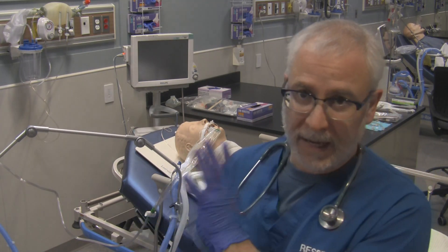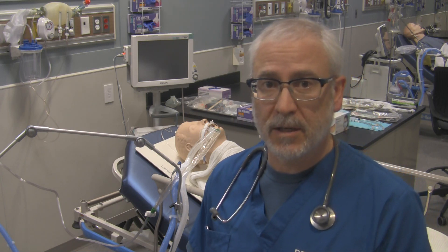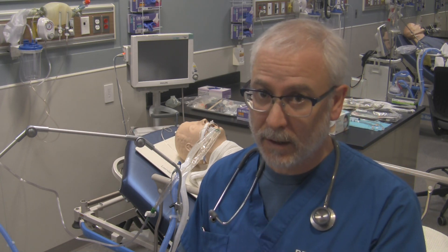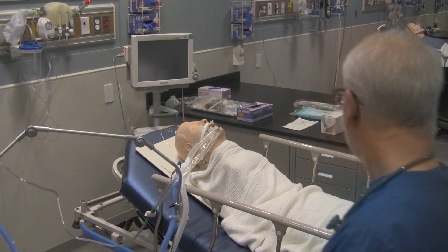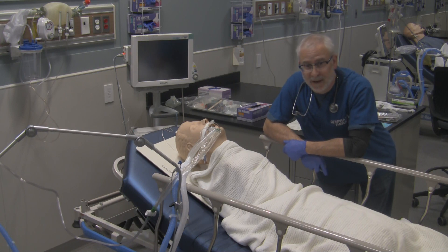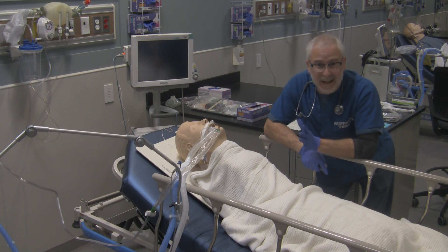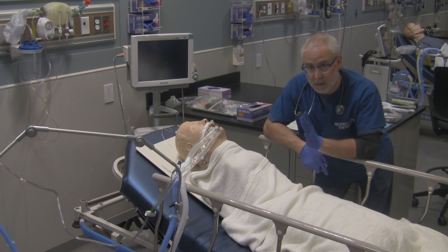Before you suction your patient you have to assess the need for suctioning — don't go routinely suctioning patients. You should only be suctioning the tracheal airway when it's required, because this can be very hazardous to your patients. We'll go to our patient. For this video I'm using a mannequin because it's really hard to get consent from real patients for demonstrations. The patient is receiving ventilation from a mechanical ventilator and is on the monitor.